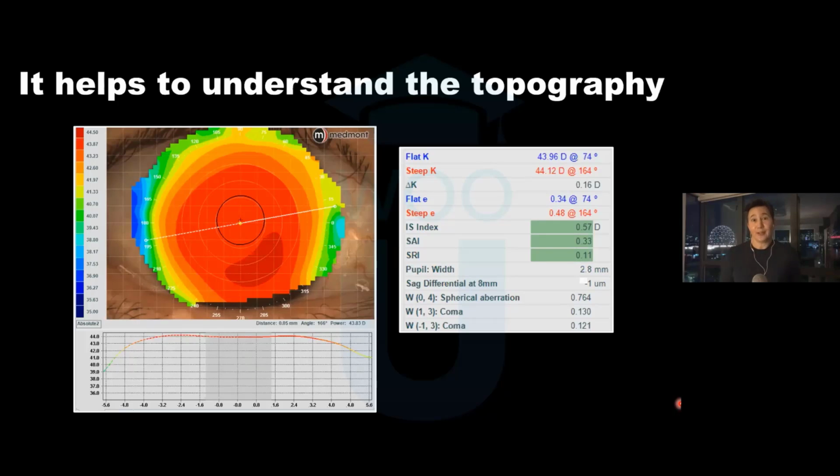When we think about orthokeratology lenses, they need to be microns away from the eye, not 20 microns as in a normal corneal GP or hundreds of microns as in a scleral. In an Ortho-K lens, it's literally just microns above the eye surface. So we need to get the topography right.